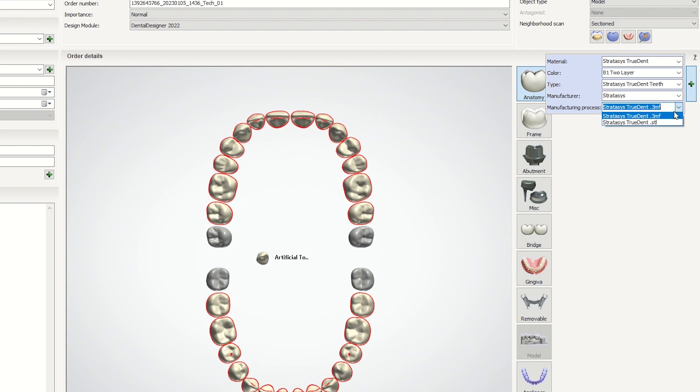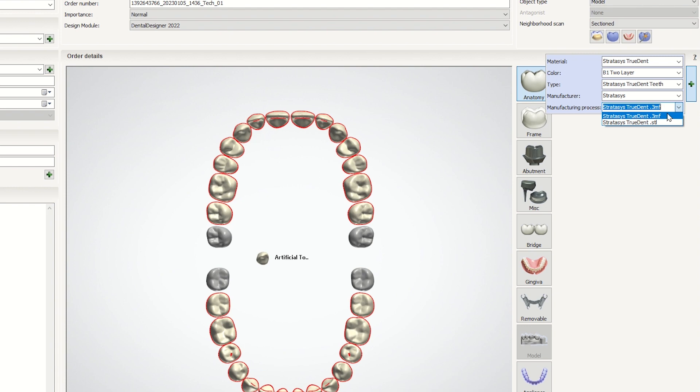Under Manufacturing Process, you can choose between STL and 3MF. When selecting STL Manufacturing, you will need to assign the colors when loading the finished model into GrabCAD Print. When working in a 3MF manufacturing process, the colors will be assigned automatically. This feature is only available on 2022 version of 3Shape Dental System and up.